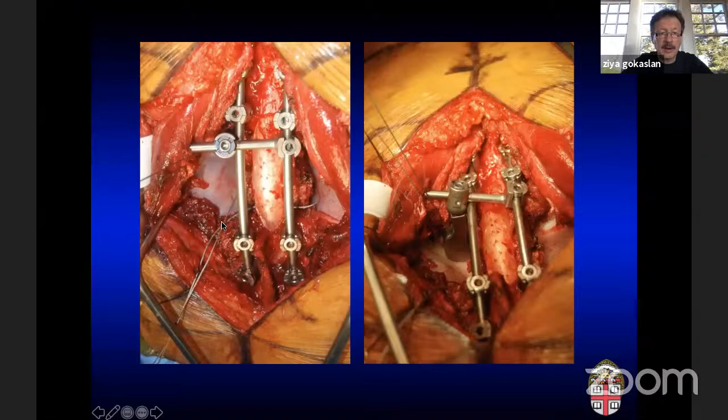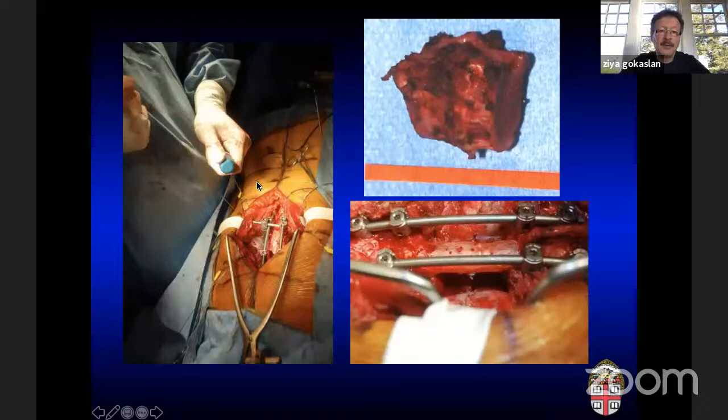And these wires then are passed through this pulley, one above, one below. There are two wheels here. And then you can cut the spinal column away in this direction. And you can see you're cutting it now. And this allows you to make very precise cuts. You can cut through the bone, you can cut through the disc space, and that allows you to resect it.